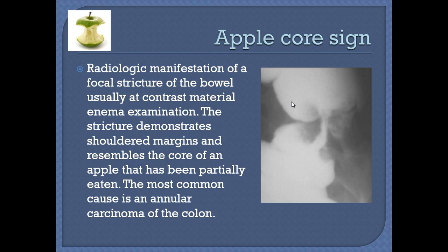Small bowel enema is sometimes called small bowel follow-through series. We can use air admixed with the contrast in the barium meal or swallow in the form of an Eno sachet, and in the barium enema we inject at least 50 to 100 cc of air per rectally.